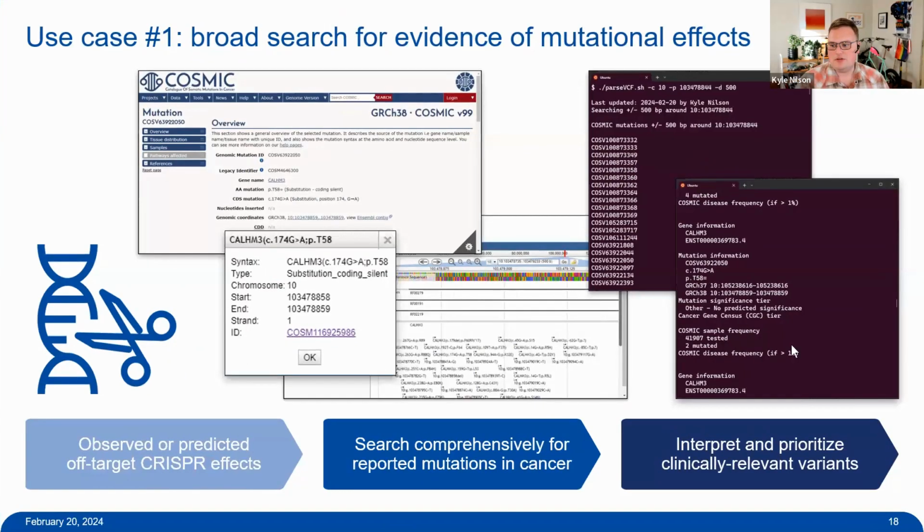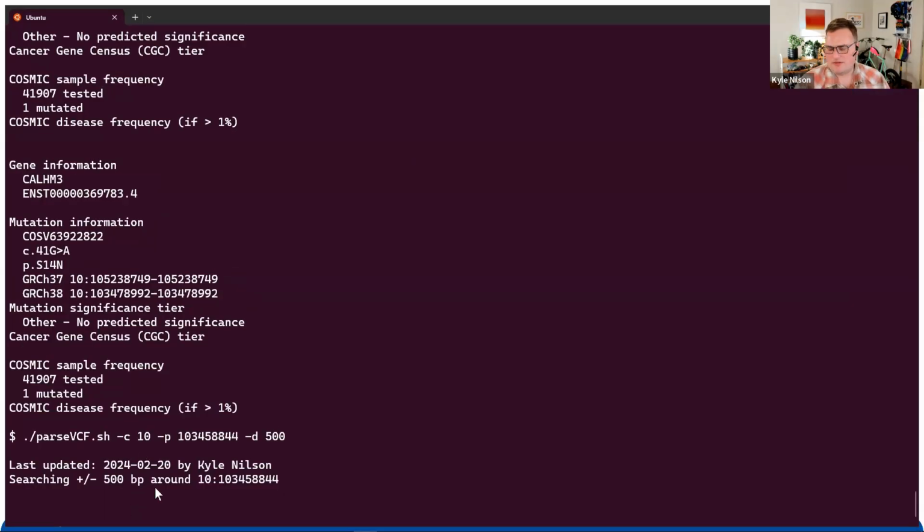And so this might take a second, but ultimately, the main thing to point out about this is you have the ability to look at all of the variants within a given region programmatically, and you can easily pull out information related to ClinVar, gnomAD significance. You have access to expert interpretations for whether or not these are causal variants. And you also have access to actionability data, which can help link a given mutation to known drugs as well as known specific cancer types. And just peeking over to see if this is done. Unfortunately not.